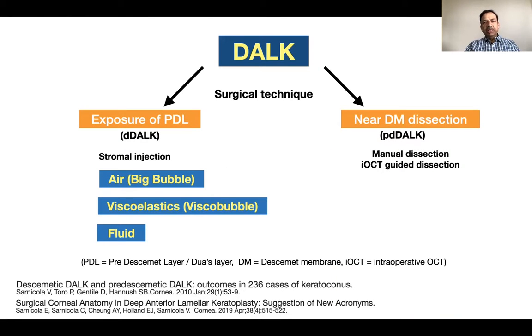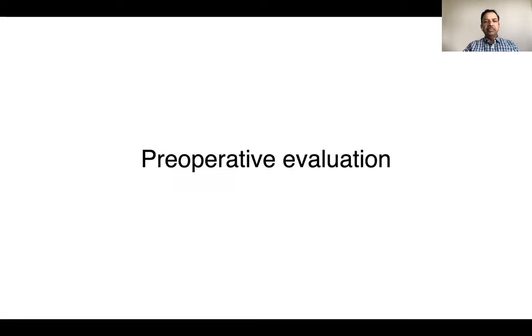When you talk about DALK, there are basically two techniques. One is a technique where you expose the pre-Descemet's layer, referred to as the DDALK or Descemetic DALK. This can be achieved by stromal injection of air, viscoelastic, or fluid. The other one is a manual technique of near Descemet's dissection, often referred to as PD-DALK or pre-Descemetic DALK. And it can also be intraoperative OCT guided as well.